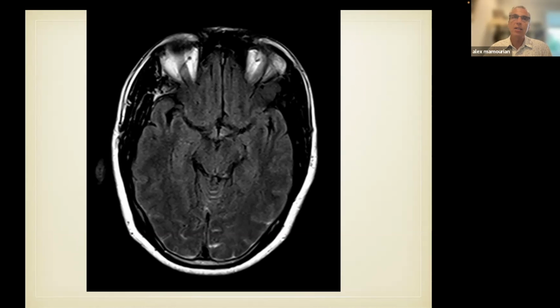So the algorithm I use is, if I see an abnormality in the subarachnoid space and I don't have a strong feeling from the history, I go to spinal tap. But do the other scans help you discriminate blood from pus? My experience is no, it does not.